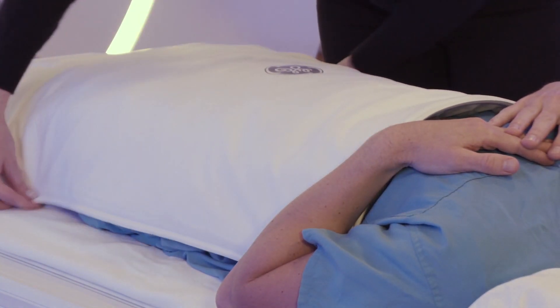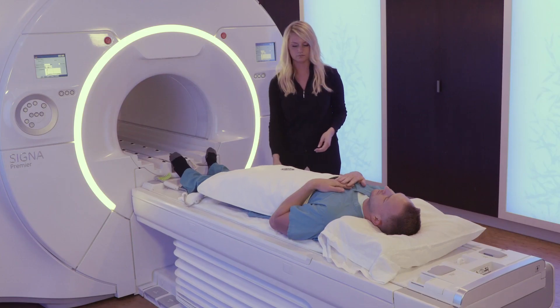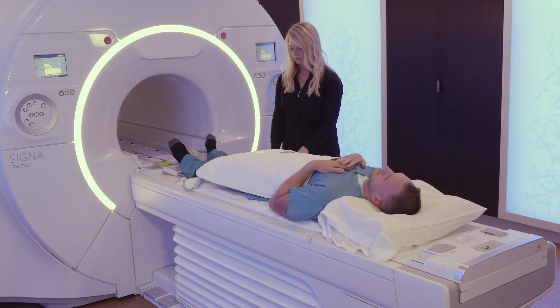With the flexible coil design, it can easily be tucked tightly around the body. If preferred, use a strap to secure the coil.